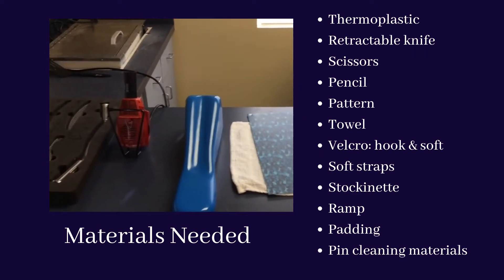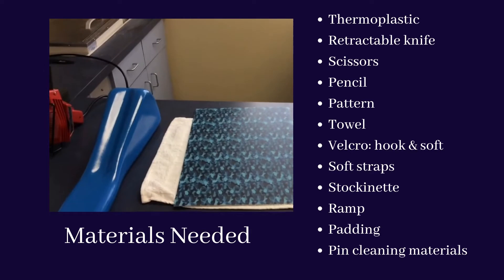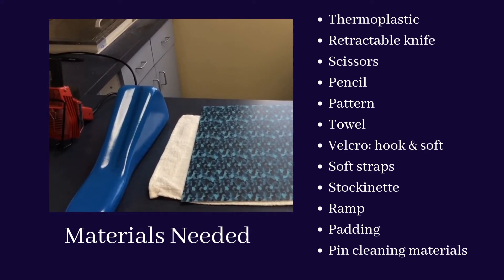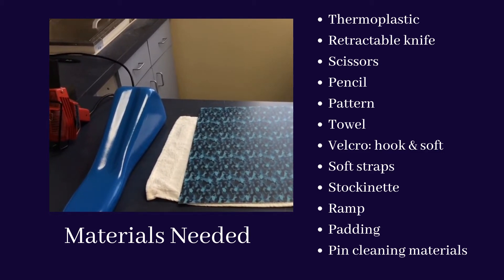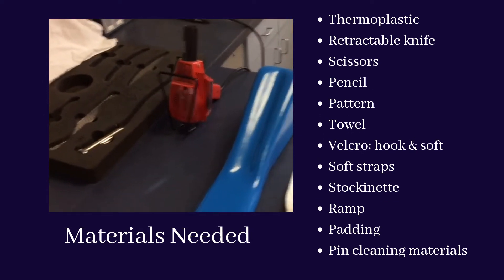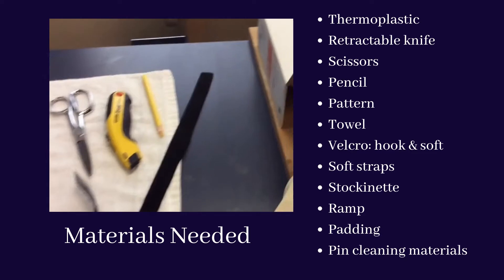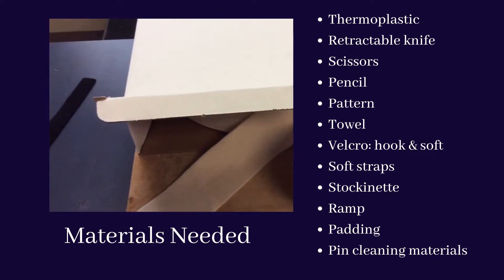First, gather all of your appropriate materials needed, including thermoplastic, a retractable knife, scissors, a pencil, a pattern if you are using one, a towel, velcro hook and soft straps, stockinette, a ramp for positioning the patient, padding for bony prominences, and pin cleaning materials if the injury is post-operative.